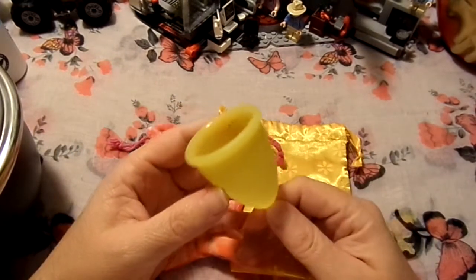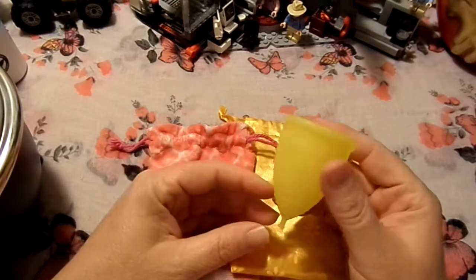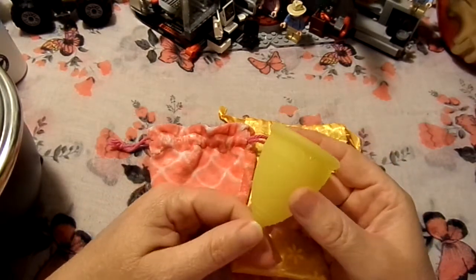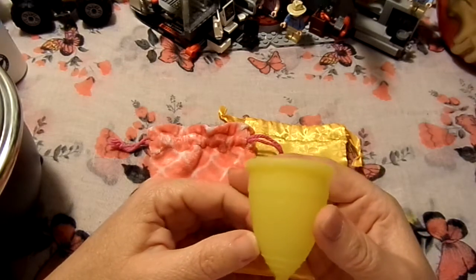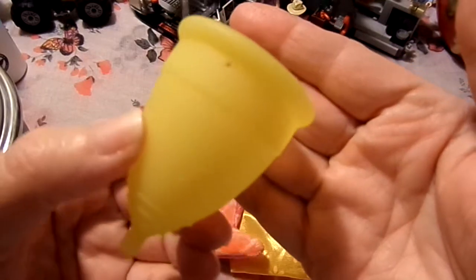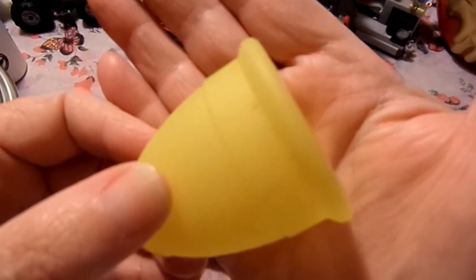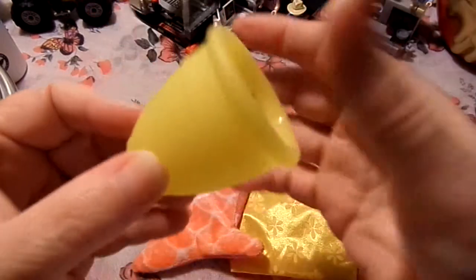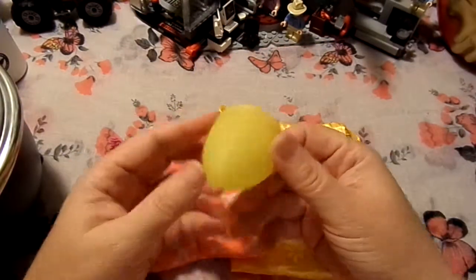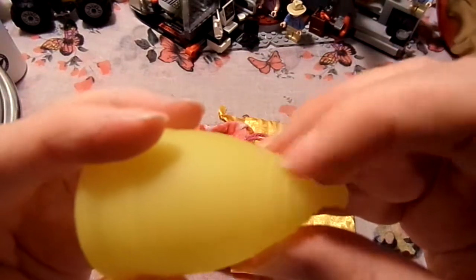Okay, so this is the Lunette cup. This is the large Lunette cup. And obviously Lunette cups do come in a variety of colours. It does have Lunette printed on the outside. Not sure if you can see that very well. Maybe if the camera would focus. Maybe not. Okay, so you've seen it's got these types of grip rings.